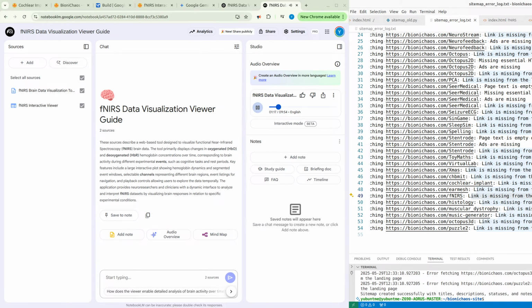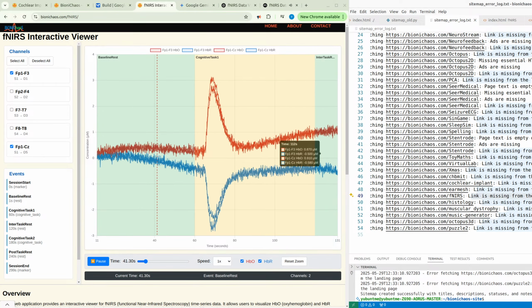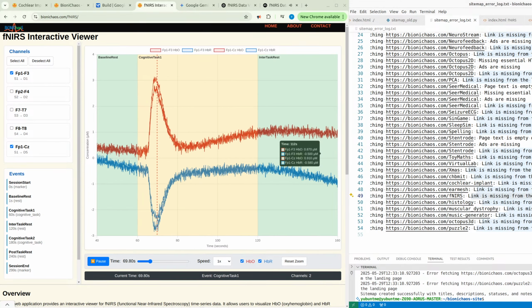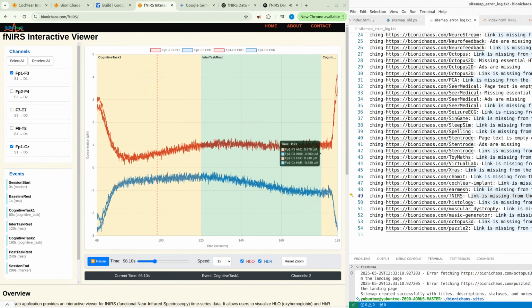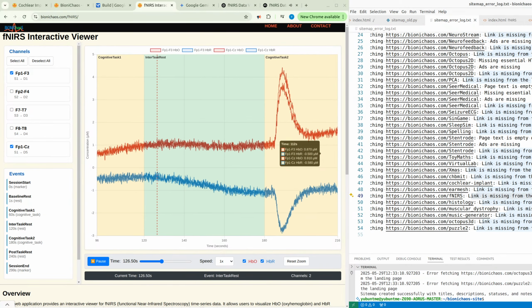How? Like shining a light? Basically, yeah, near-infrared light. It penetrates the skull and brain tissue, and HbO and HbR absorb that light differently. The machine detects those absorption changes. And that tells us about brain activity, because active brain regions need more oxygen. Exactly. More neural activity triggers increased blood flow to that area. So typically you see HbO go up and HbR go down, relatively speaking. That's the hemodynamic response. Okay. But you're getting these HbO and HbR signals from maybe dozens of locations, all changing second by second. That's the complexity. Which is why you need a tool like this one we're looking at.